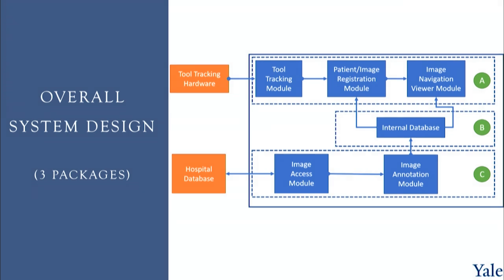The blue boxes here are the different modules. The orange boxes here is the external world. So for example, let's see what happens in the operating room. We have tool tracking hardware. It connects to our tool tracking module, which provides information to the registration module, which also gets information from the database. This provides information on the mapping to the navigation module. And here come the images. And so now here we can draw the display. The others are similar in the same way.